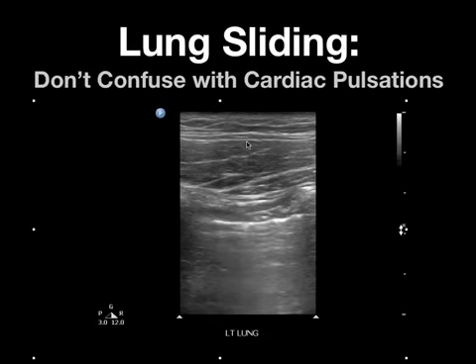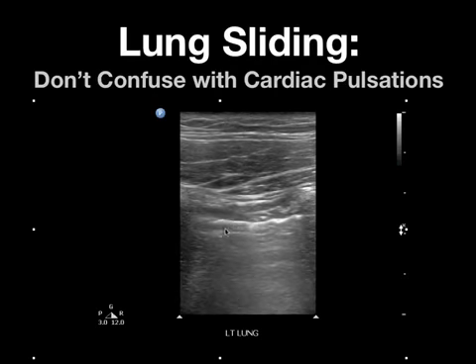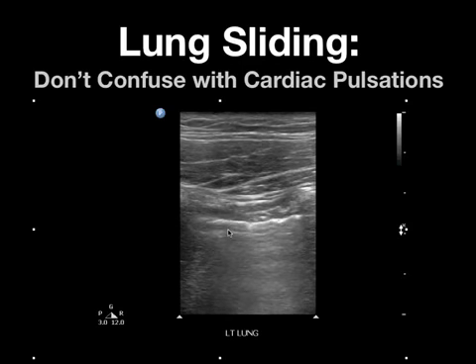Do not confuse lung sliding with referred cardiac pulsation. Here was an image I obtained on myself during breath holding, and you can see that there is some movement back and forth, but this is due to referred cardiac pulsation and not lung sliding due to respiratory phase.